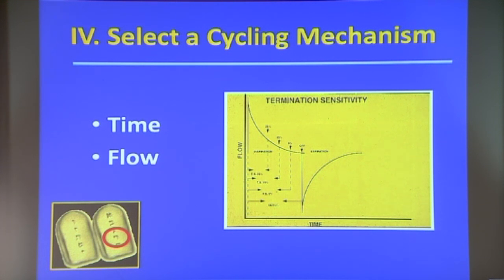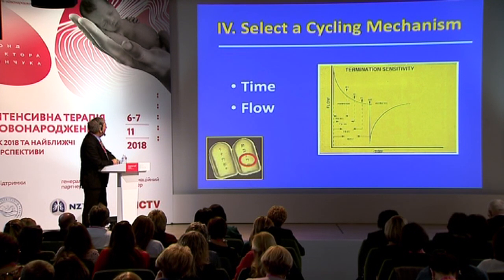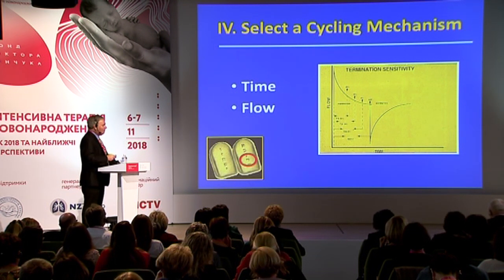And what you see on this graphic is one ventilator breath delivered to the baby. And if you remember, our flow waveform has 4 components. We have accelerating inspiratory flow, decelerating inspiratory flow, accelerating expiratory flow, and decelerating expiratory flow. Now I want you just to concentrate on the inspiratory side of this cycle.